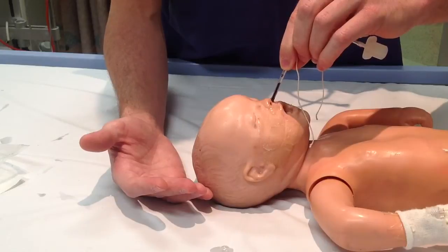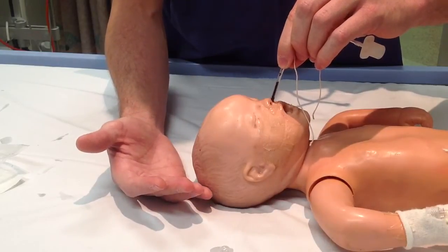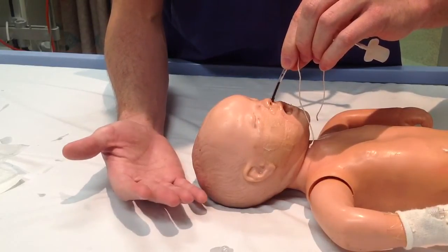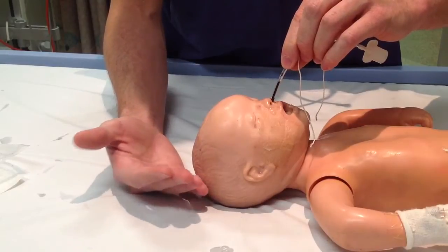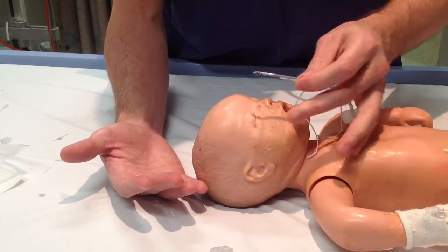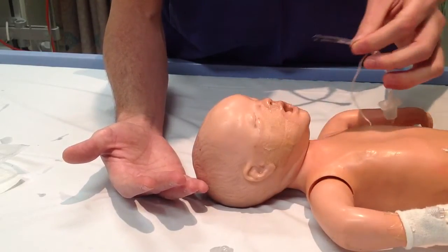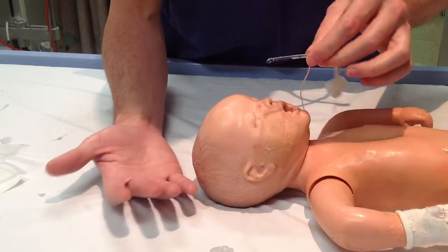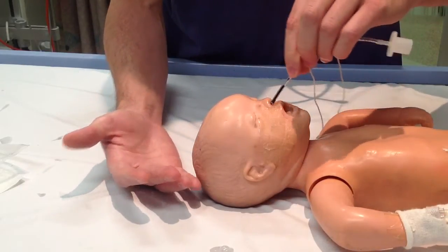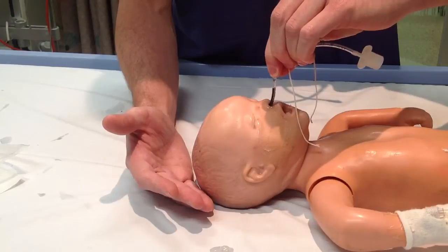Keep in mind that in a certain subset of paediatric patients, no airway will be passable — patients with choanal atresia, for example. Sometimes you might just need to use a smaller tube. Apply gentle downward pressure.